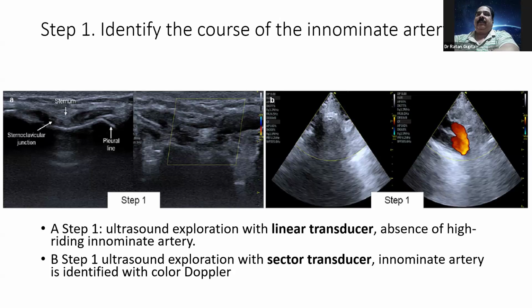Yes, sir. So ultrasound is really useful when we are doing a percutaneous tracheostomy, and it gives you a lot of confidence. I have been regularly using it to rule out major vessels in the pretracheal field, and once you have decided you are in the center, I do it offline. I don't do it real time, but I think it might be worth trying doing real time.